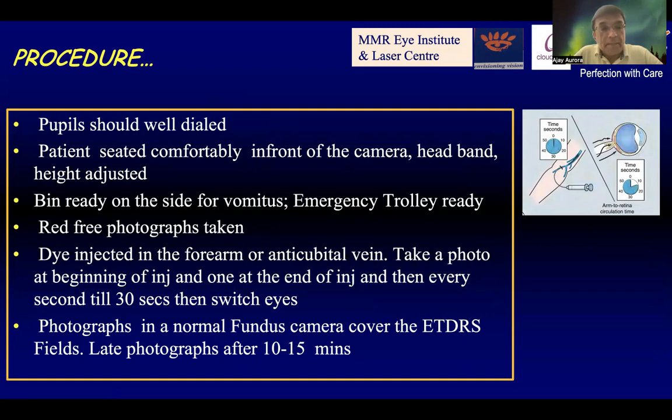We should have a bin ready by the side of the patient, so that if the patient vomits, the patient should not vomit on the equipment. The patient should vomit in the dustbin which is provided for it. And you should be ready with your emergency kit.